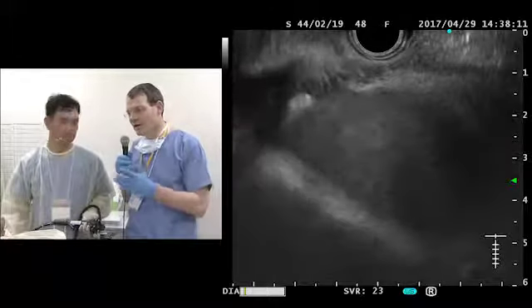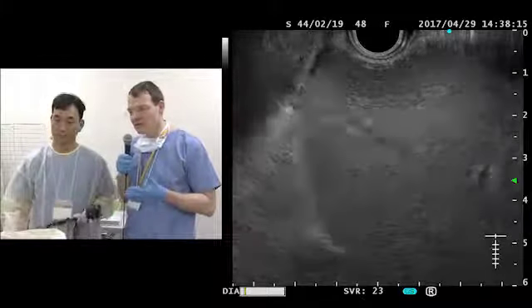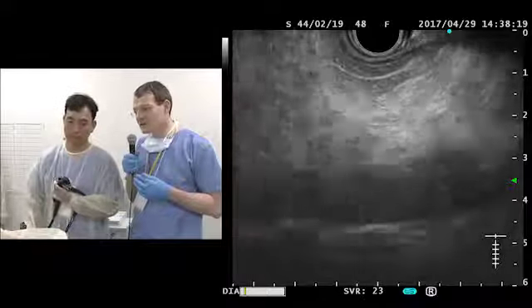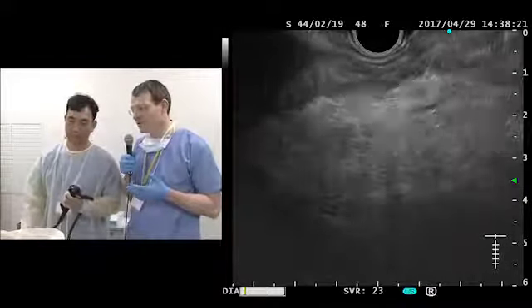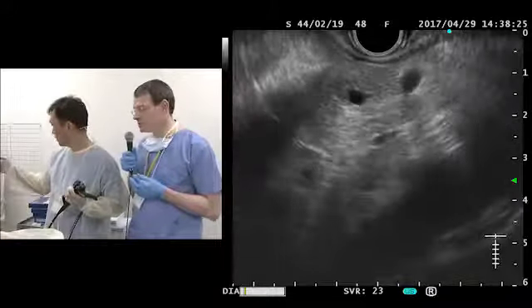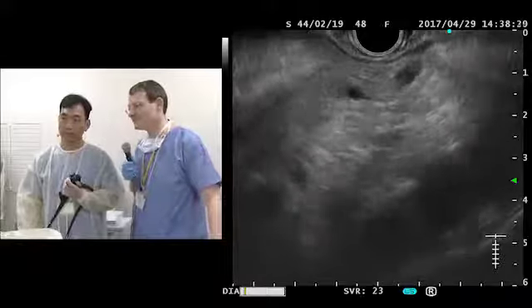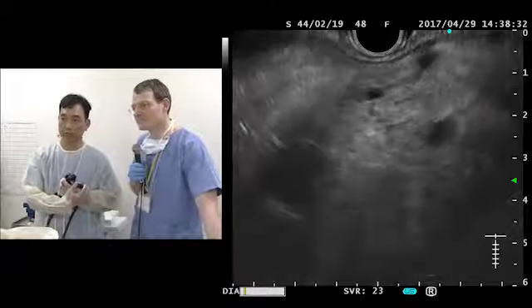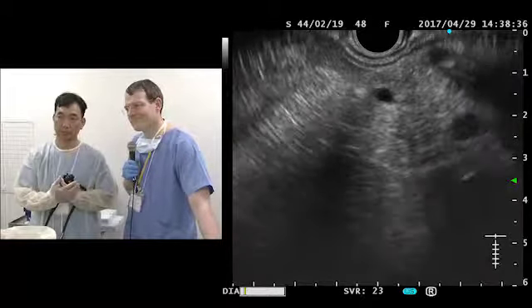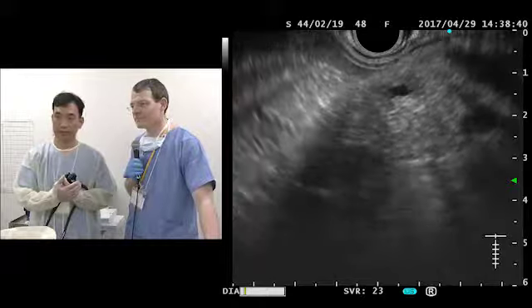Yep. But I think here we nicely saw it's a suspected lesion. We have to exclude malignancy, but what we have found sounds like a focal pancreatitis. But I think this patient also needs observation. How would you follow up the patient in the future? Yeah, so we'll be waiting for the final pathology evaluation. Depending on the finding, imaging follow-up is definitely mandatory, making sure that we're not missing anything.